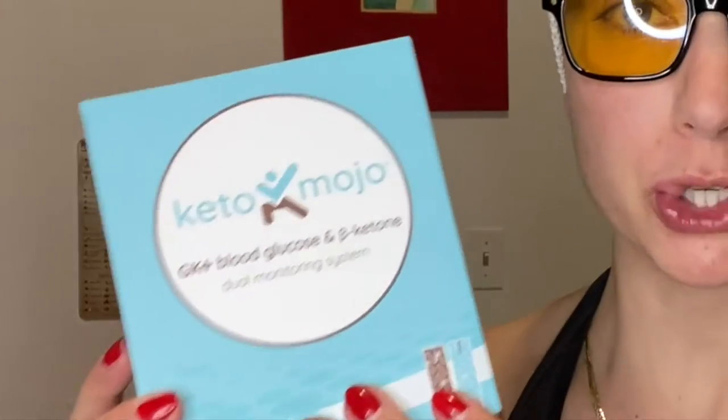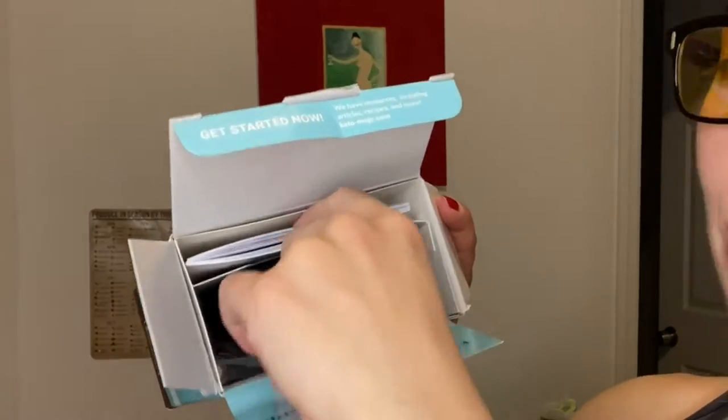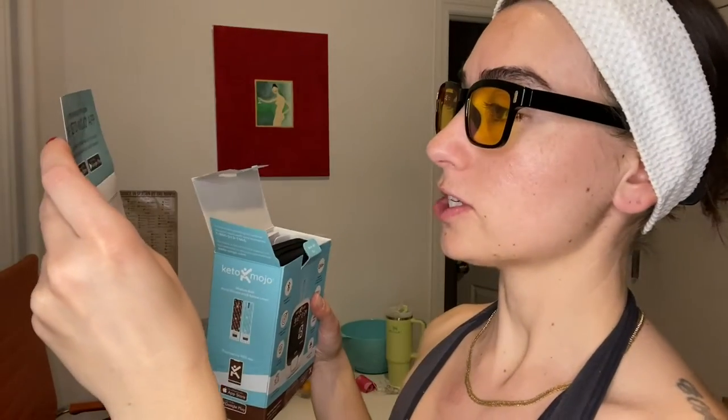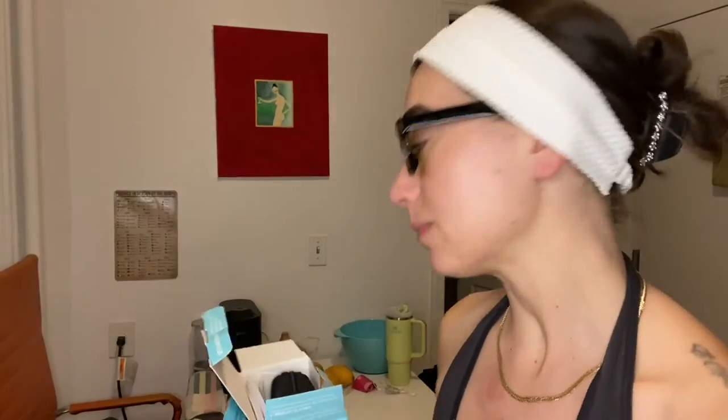Okay so in my hands I have this very anticipated Keto Mojo that I've been waiting for for weeks. It finally came in so let's unbox it — this is what it looks like. First things first, you get the free Keto Mojo app, so there's an app that comes with it.